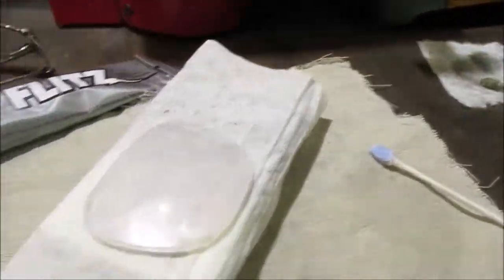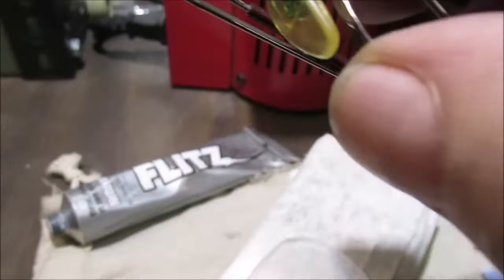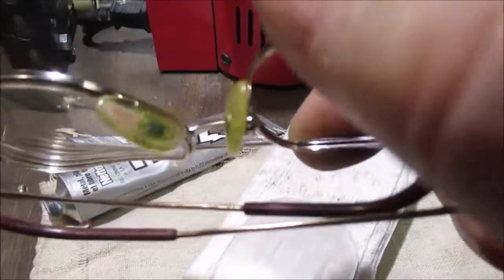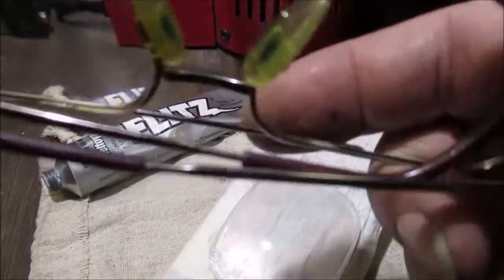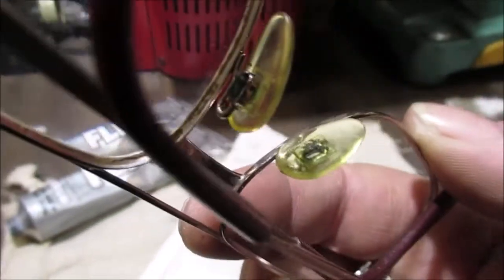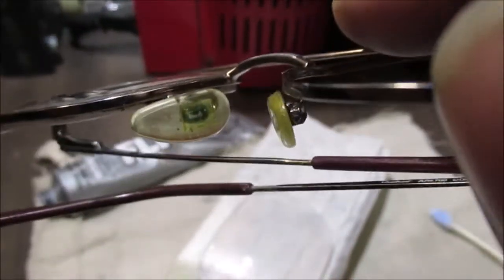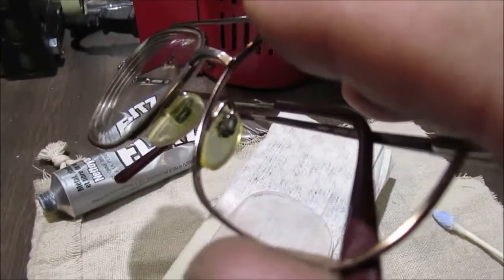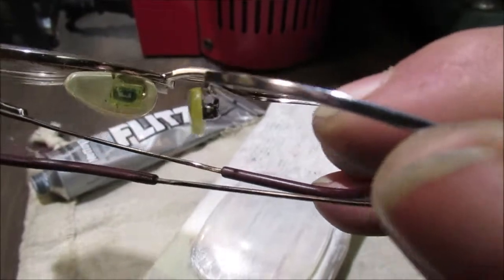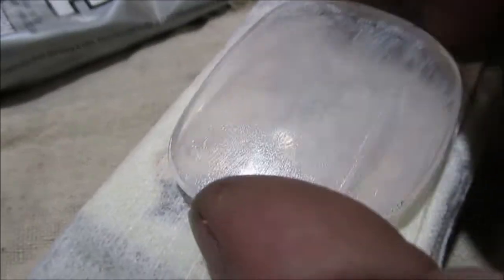We did clean up our frames with this — all the nasty gunk you get around the nose pieces. Come on, be honest, it happens. They get scummy, green, corroded and it's gross. Those were clear when they were new. We've all been through it. And in the grooves of the frame — these lenses have a ledge on them that fits in the groove.